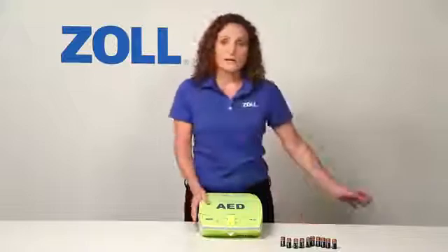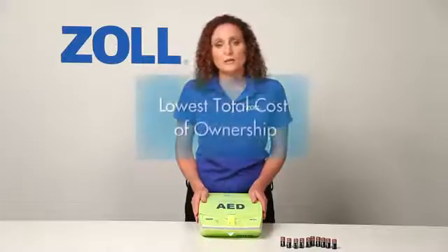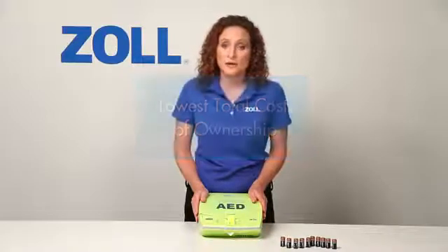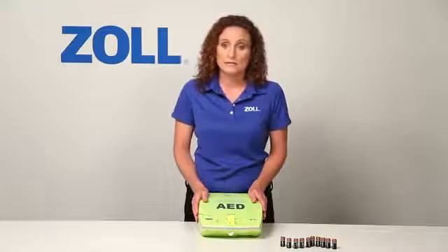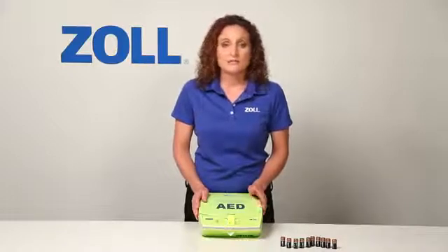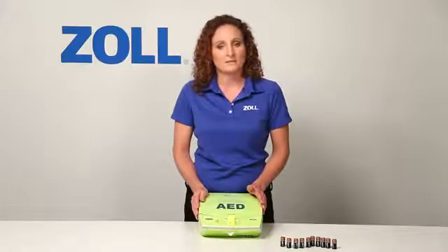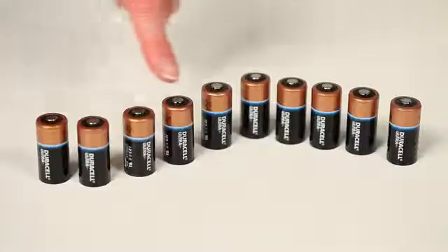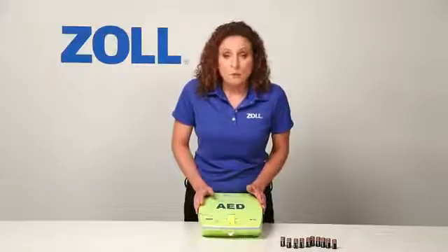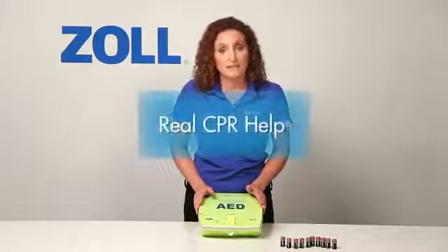So this has been a quick demonstration of what makes the AED Plus better than other AEDs. It has the lowest total cost of ownership once installed because the pads and batteries don't need to be replaced for 5 years unless used in a rescue. It has the highest ingress protection rating for particles and water of any AED from any major manufacturer. It's powered by 10 lithium batteries available at retail instead of an expensive proprietary battery pack. But most importantly, when it's time to do CPR, only the AED Plus provides real CPR help.